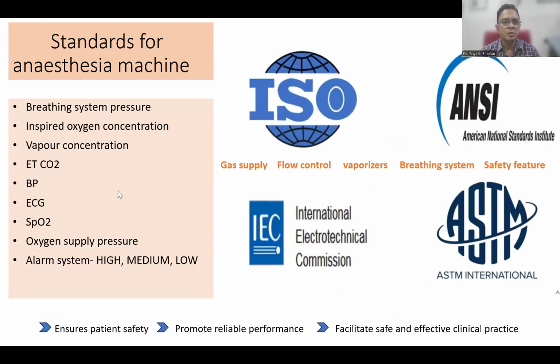Right. So who sets the standards for these anesthesia machines? Because we need basic monitoring standards like breathing system pressure, inspired oxygen concentration, vapor concentration, end tidal CO2, blood pressure, ECG, SpO2, the oxygen supply pressure, and alarm system. We all need to know, but how? That is the question. There are various organizations, like ISO, the International Organization for Standardization, and the American Society for Testing and Materials. They provide manufacturers with guidelines outlining minimum performance, design characteristics, and safety requirements, right? They ensure patient safety, promote reliable performance, and facilitate safe and effective clinical practice.